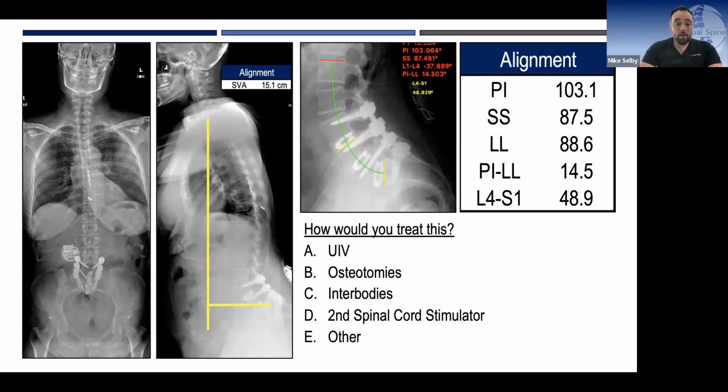This is a challenging case, right? And I think in these bad mechanical issues, a spinal cord stimulator is probably relatively low harm, but if it is put in through a laminectomy, sometimes that interferes with your upper instrumented vertebra level as well. If you're thinking about stopping around T9, T10 for these deformity patients. This is a relatively young patient. Just thinking they've got reasonable bone quality because despite the mechanical stresses, they fused that first operation. So bone quality is probably going to be okay.